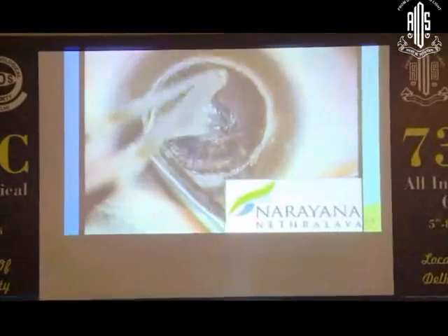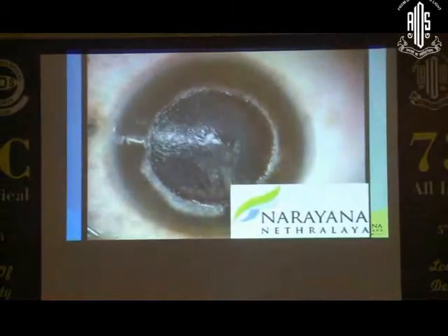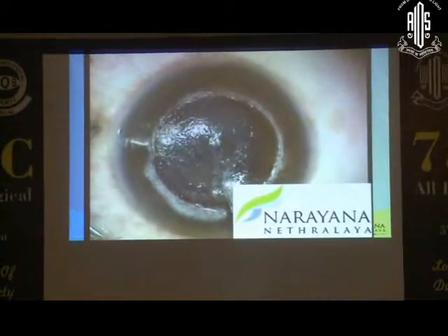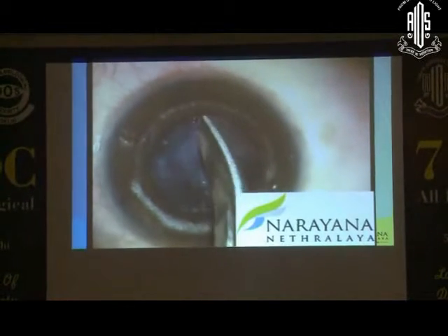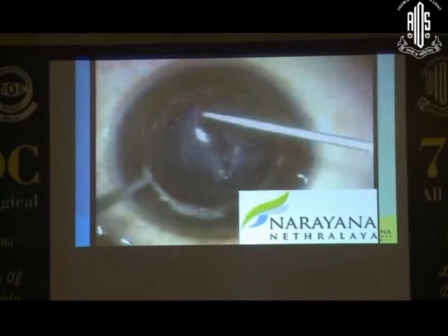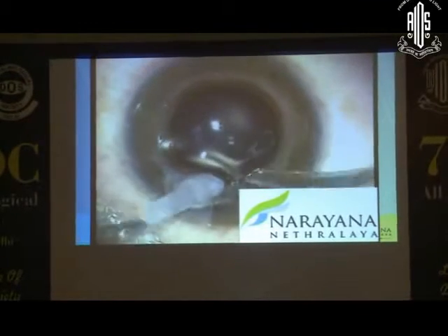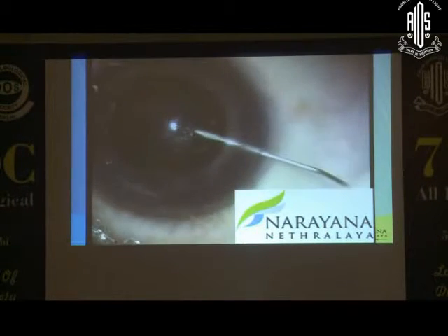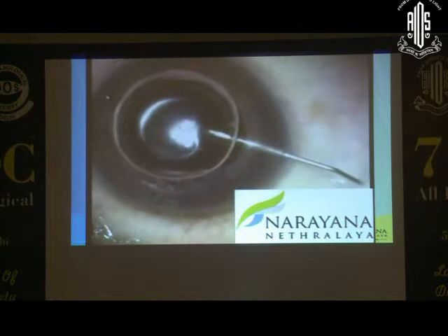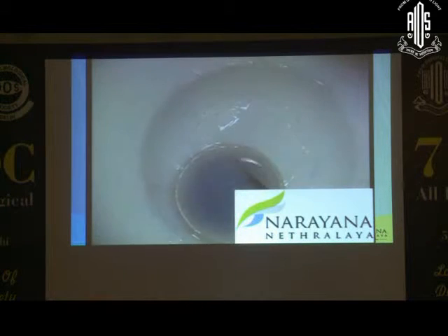All very simple instruments used, which we normally use for cataract. Then the residual stromal bed, we just nick it and then separate it carefully from the Descemet's membrane, taking care not to perforate it, just ensuring that it's separated all over, and we remove the posteriormost stromal fibers, leaving behind only the Descemet's. And injection of the air ensures that the Descemet's is intact, which is actually not necessary to do.